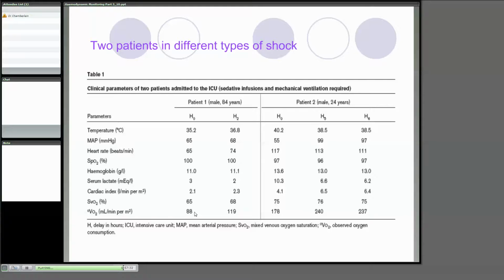Have a look. 120 to 170, so oxygen consumption is quite low, which affects the metabolic rate. And it picks up a bit as he warms up. But this chap here has a very high oxygen consumption. Now my question is, do we have hypoperfusion here?